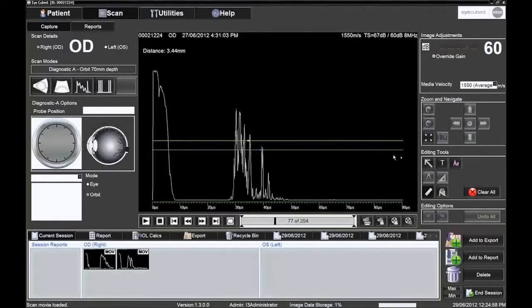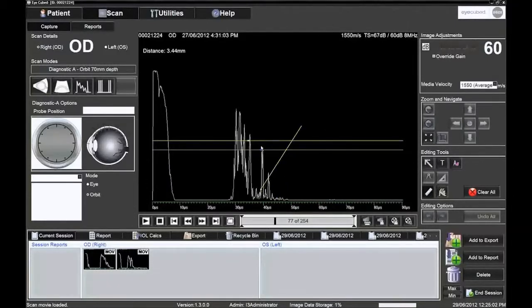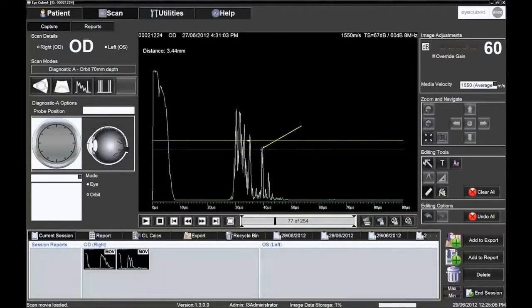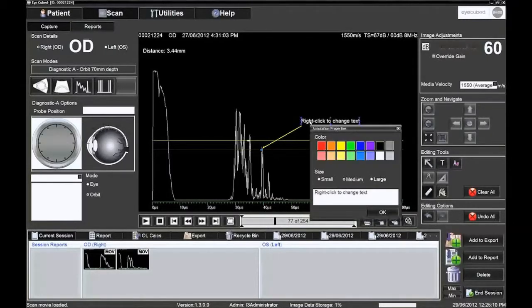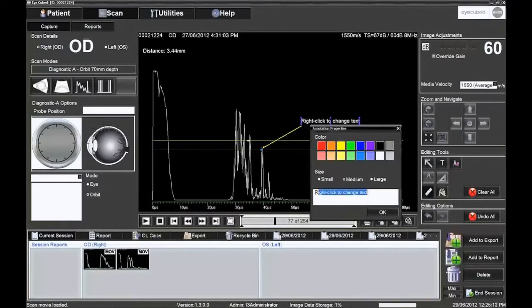Both keyboard and editing tools can be used. Other editing tools are available on the A mode image. It is possible to position arrows and text boxes for educational or referral purposes.